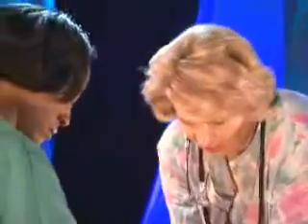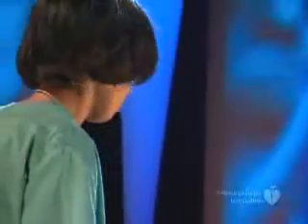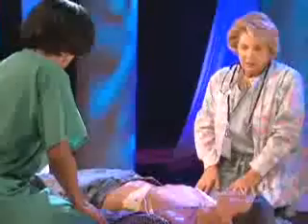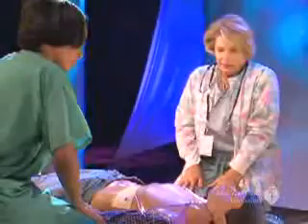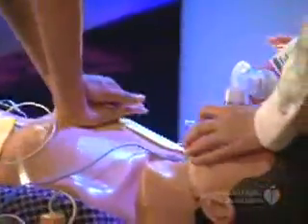Analyzing heart rhythm. If the AED finds a heart rhythm that could be treated with a shock, the AED will tell you so. Shock advised. Stay clear of patient. Deliver shock now. The AED will then tell you when to push the shock button. I'm clear, you're clear. Clear. We're all clear. When the shock is delivered, the victim's muscles will jerk. The AED will then tell you to start CPR, beginning with chest compressions.